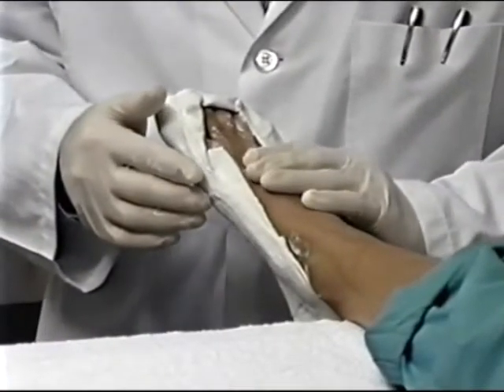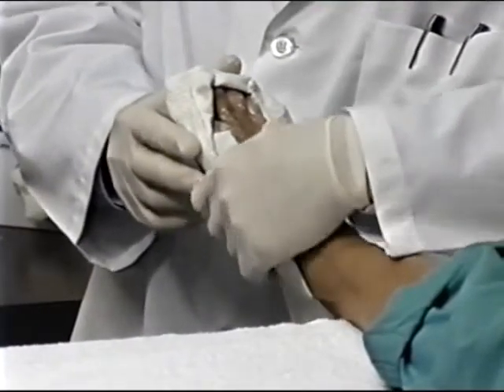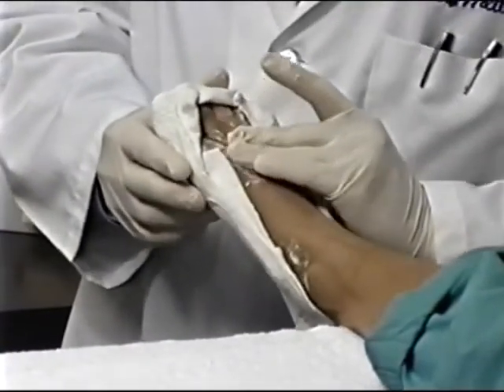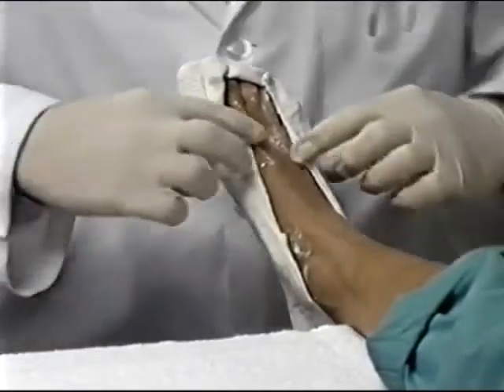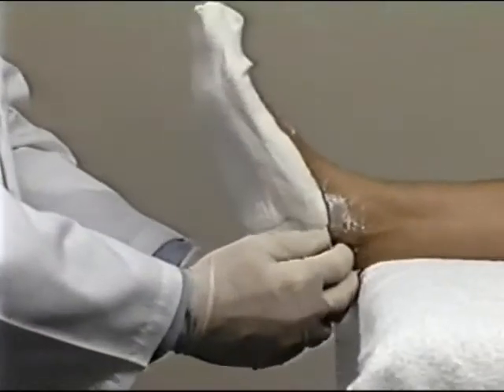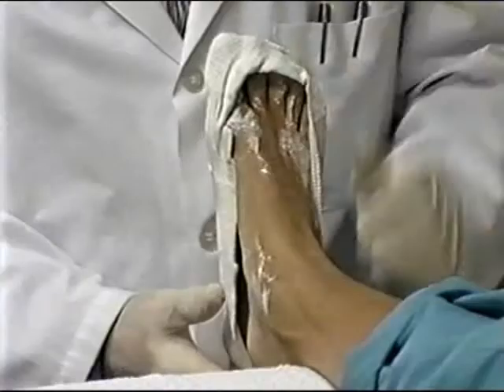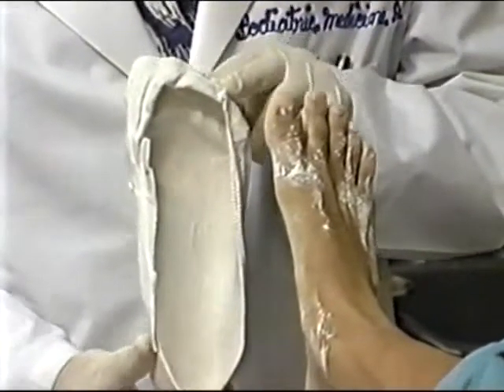Before removing the cast, break the adhesion between the patient's skin and the plaster splints by gently pulling the skin upward all around the cast, being careful not to deform the shape of the cast. The heel of the cast is removed first. Then the plaster cast is pushed directly upward and averted without the patient's assistance.